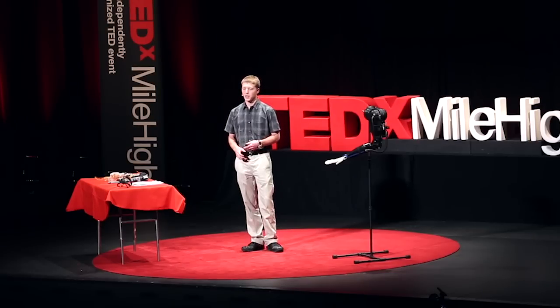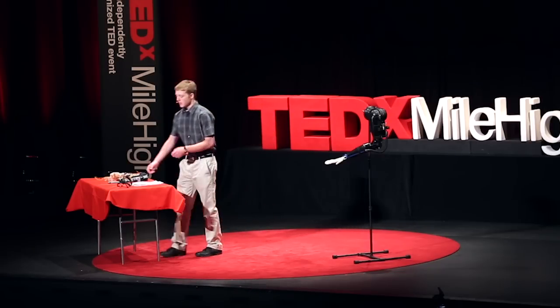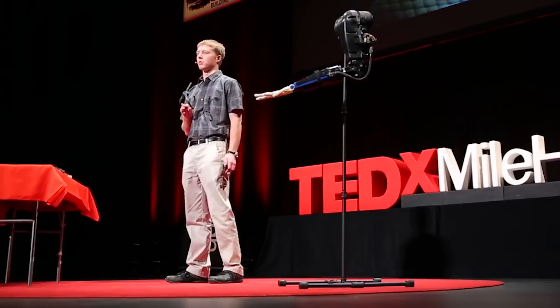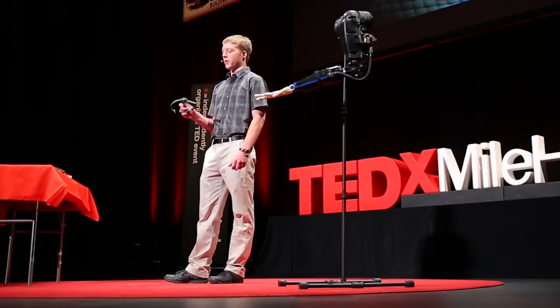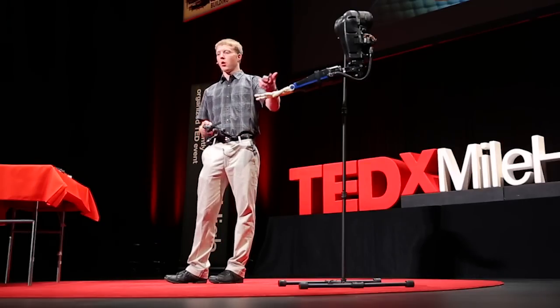I started looking around and wanted to keep everything external — get rid of all the surgeries and just have something simple that you could put on every day, take off whenever you need to, and conceal easily. This is the EEG headset. It reads about ten different channels of your brain, it's all wireless using Bluetooth. And this is the newer arm that it actually controls. Although it's only sending data a few inches, that eliminates the wires going from your head to the arm — and for prosthetic users, that's a big psychological aspect.